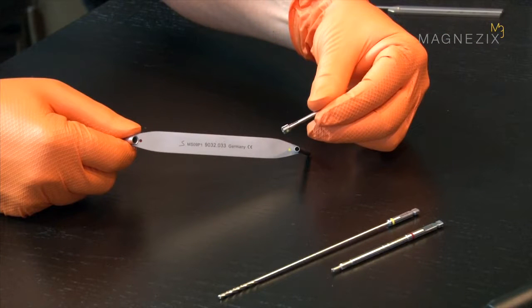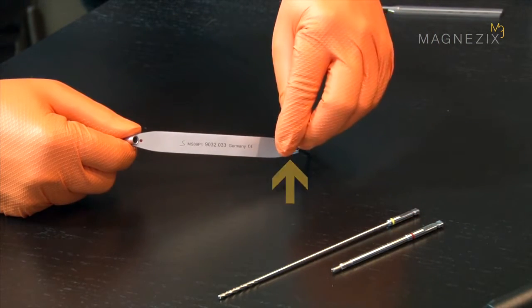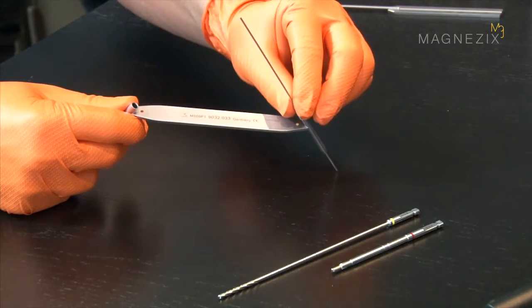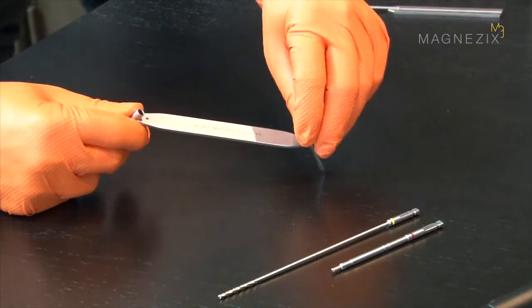Position the guide wire through the double drill guide with the drill guide attached. Make sure you use the correct color-coded tools here. The drill guide must be removed before you drill the pilot hole to the desired screw length using the cannulated drill bit directed by the underlying guide wire.